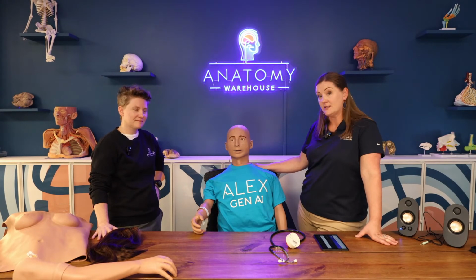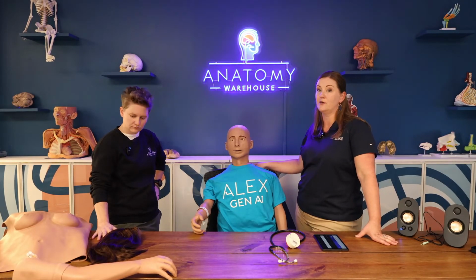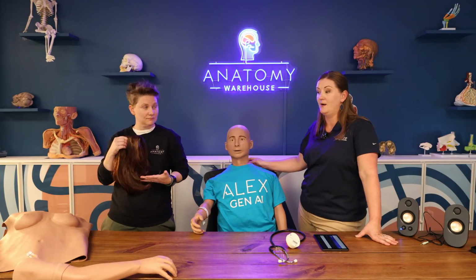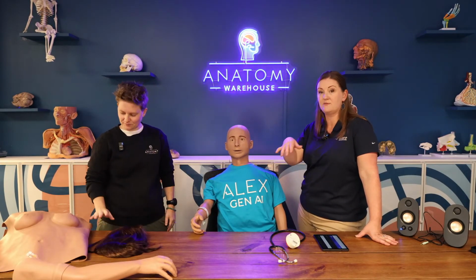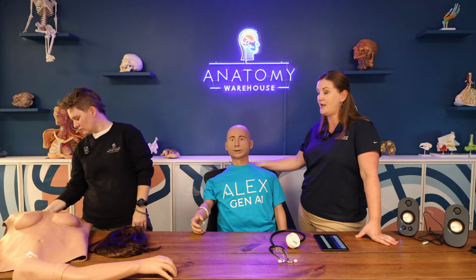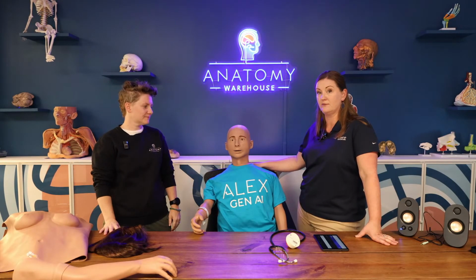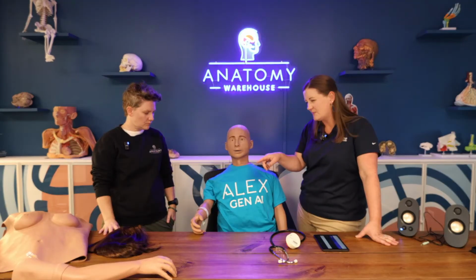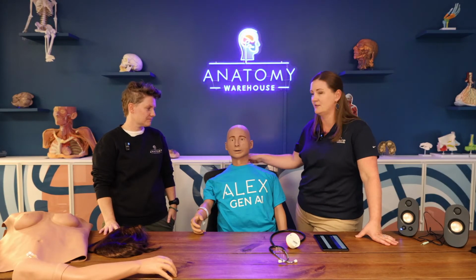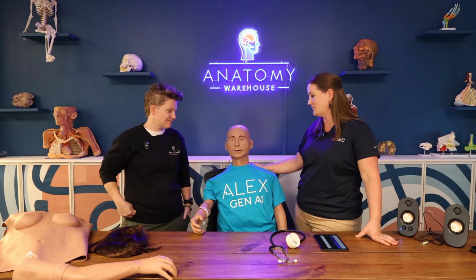Alex comes out of the box as a male, but he is easy to convert into a female. So we also have the female update kit here on the table. It comes with a different chest skin that's very simple, in the form of a zipper system on the shoulder and at the side. It just zips on and zips off so that you can change Alex at a relatively fast pace. It also comes with some hair, I believe some makeup, and there might be some eyelashes still in the package. Some of that stuff gets lost over the course of multiple shows that he's been at.